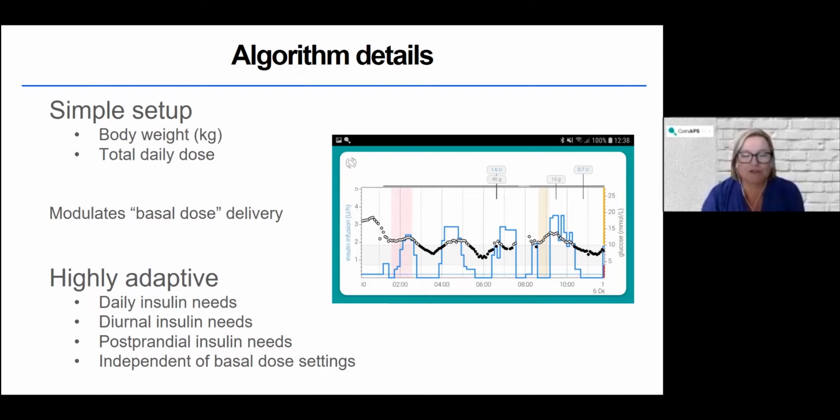So it's being able to cope with that variance between day and night, in women between menstrual cycles, post-meal glucose readings, as well as being able to adapt for different times, so stressful times, maybe when you're not as active, or when you may be ill or doing some more active periods of time.